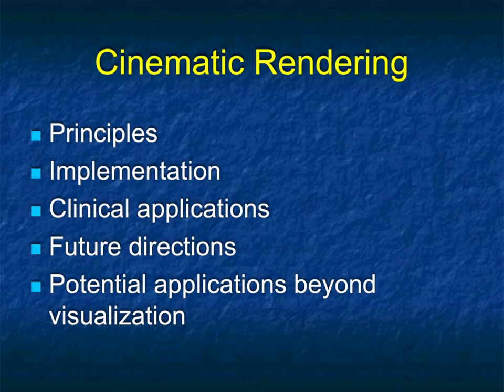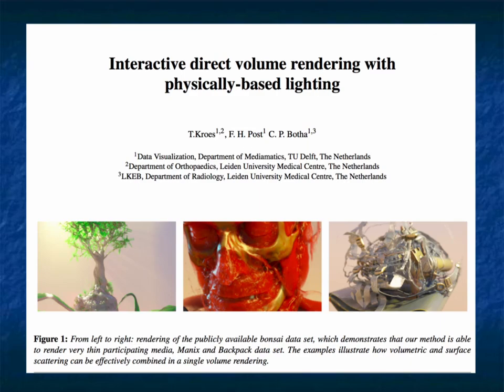So things we're going to look at are principles, implementation, clinical applications, future directions, and potential applications beyond simply visualization. Now, if you have to give credit, you always need to make certain that you thank people who've done some of the critical initial work.